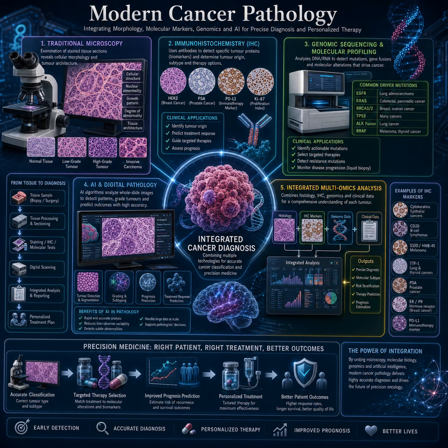Artificial intelligence is now adding yet another powerful dimension. AI algorithms analyze whole-slide digital pathology images containing millions, even billions of pixels. They can identify subtle patterns invisible to the human eye, assist with tumor detection, classify tumor subtypes, estimate tumor grade, predict prognosis, and even anticipate response to therapy.